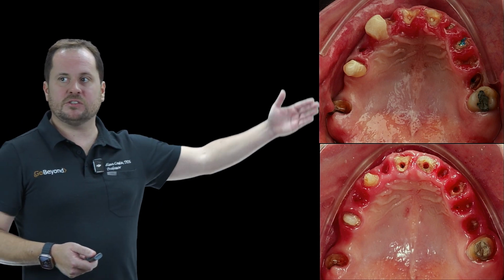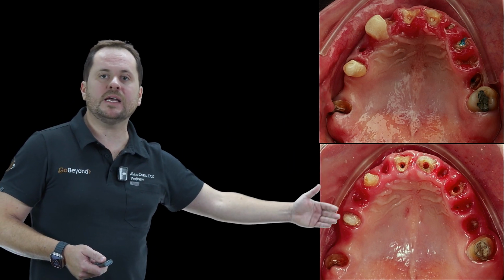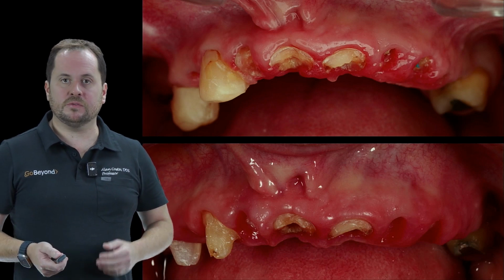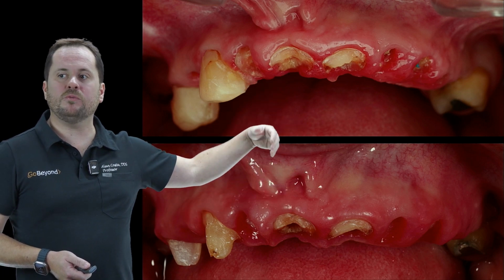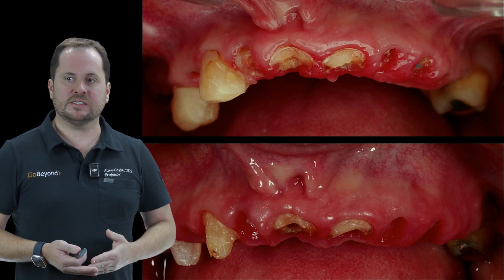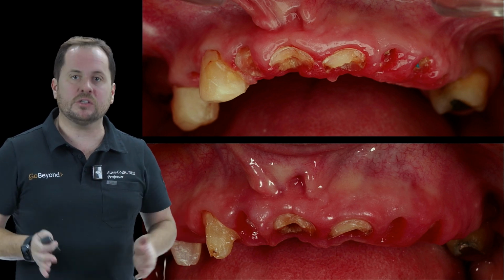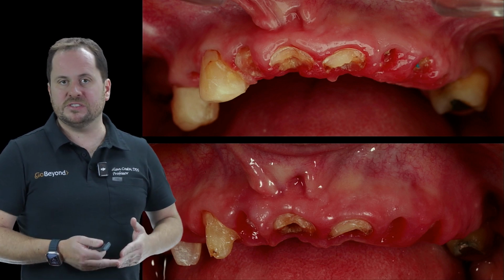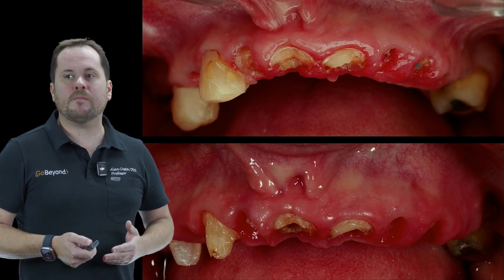So here in this image, as you can clearly see, it's a comparison of the initial phase of the patient and then 5 weeks later, showing the evolution of the gingiva. So look at this image, this situation and then this one here. See how there was an improvement in the tissue? We already have much more confidence when doing this type of work. I haven't even gotten to the surgical part yet. I haven't even planned the surgical part yet. I'm making an adjustment in this patient's environment so he can receive these implants and this new prosthesis in a much more favorable tissue condition.